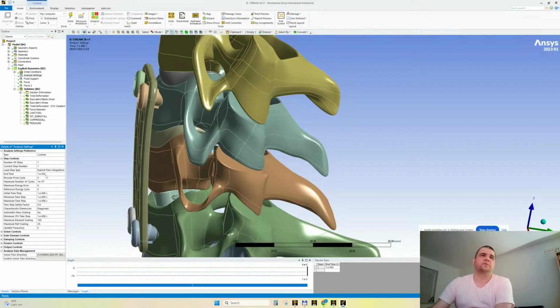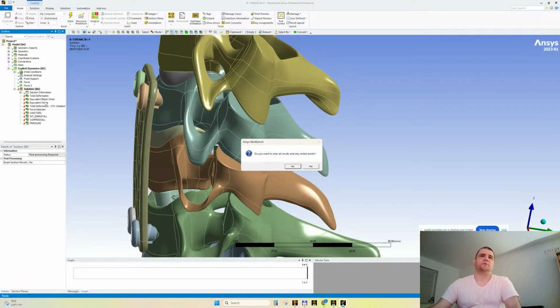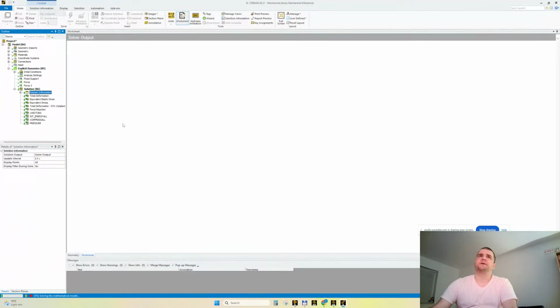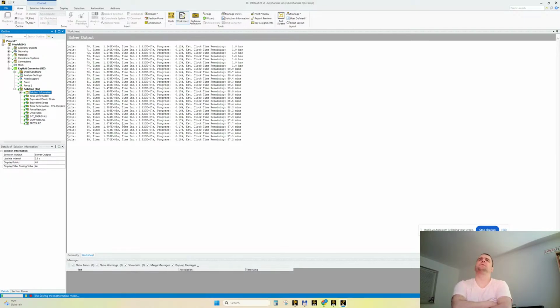Maybe in the end I will make here 0 point, I will half the end time. I will split it in half, maybe, if the difference is not noticeable. If we still stay with above 50 minutes of solving. So how much does it take? 50. So no big difference.